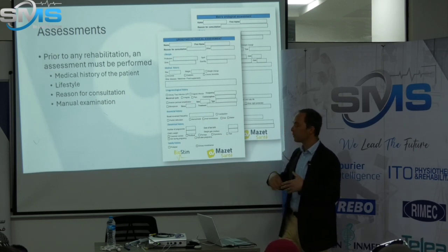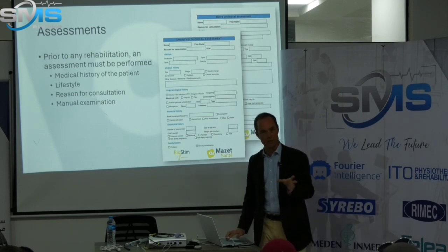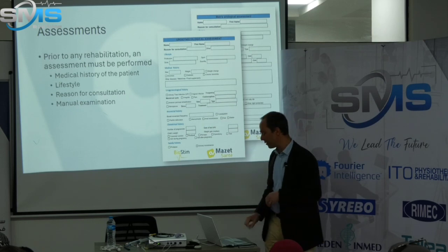Of course, you have to talk with her and understand the reason for her consultation, because if she comes, she might have a problem, and she has to describe it as precisely as possible to help you find the right techniques for her. And the last point, a very important point, is the manual examination.